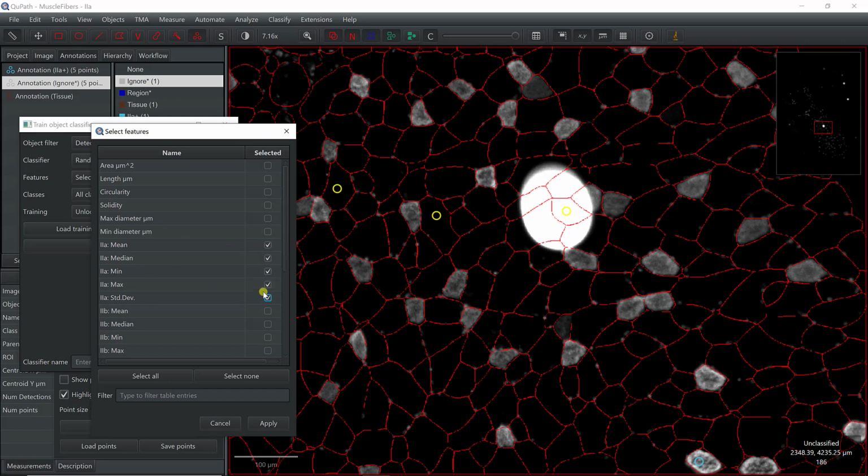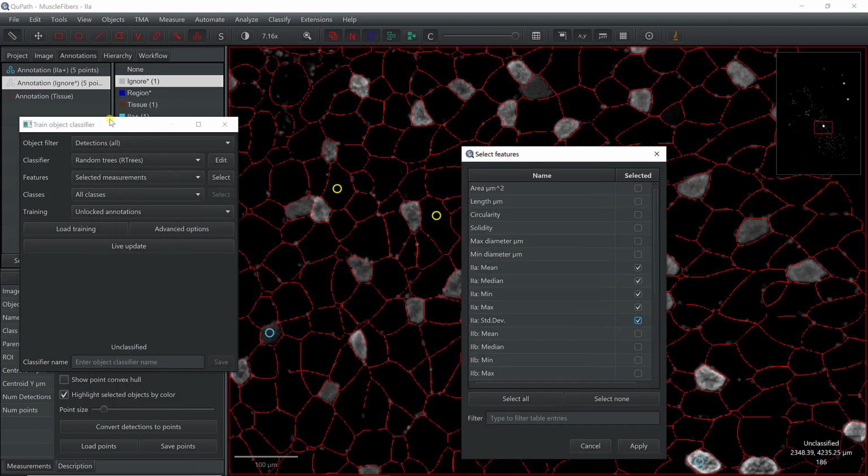And that's it. If you know that 2A is incompatible with another fluorophore, you could use this fluorophore. This actually is a negative way to show an example, but when we're going to do 2B, we know that 2B and 1 cannot overlap.